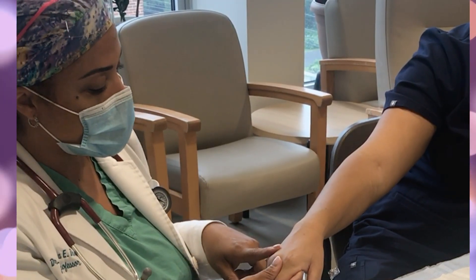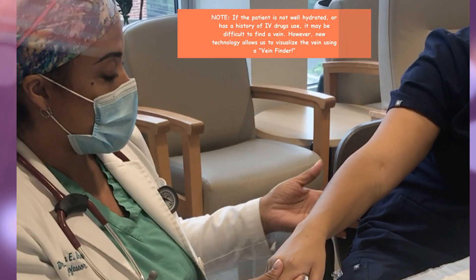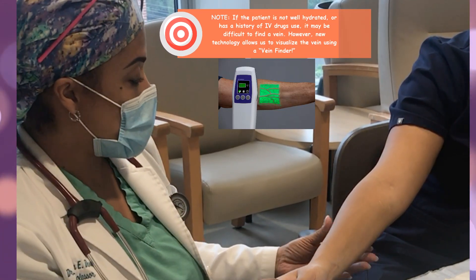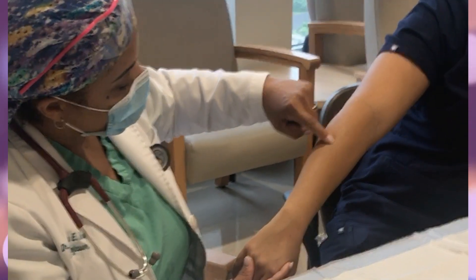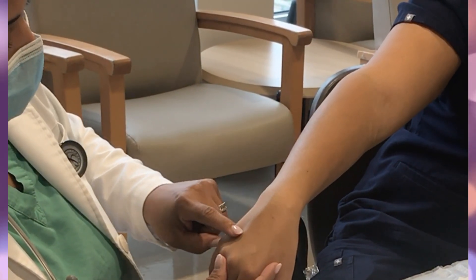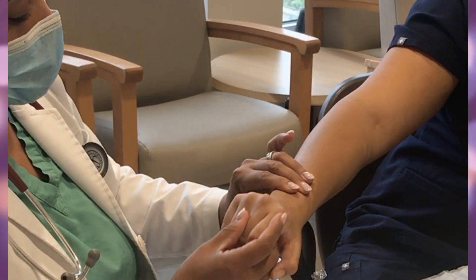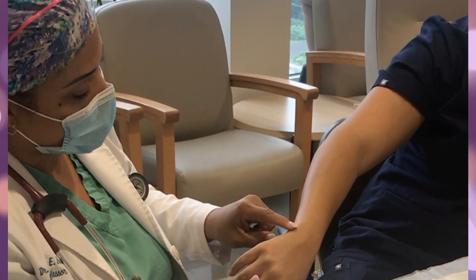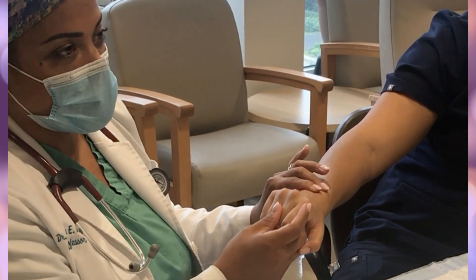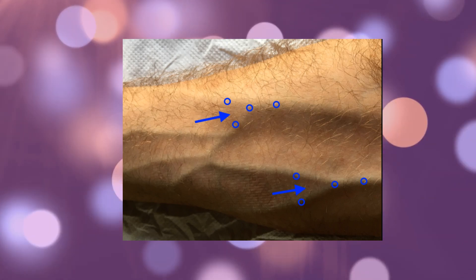The last place I look is the hand, as a lot of patients complain that it is very painful there, so I try to avoid it unless I can't find anything else. Usually in the forearm, depending on the hydration of the patient, you'll find a good vein — for example, she has a good vein right here, as well as in her wrist and hand. However, the wrist bends, and the vein right here is right on the wrist bone, so it can also be painful and is also at a bendable joint.